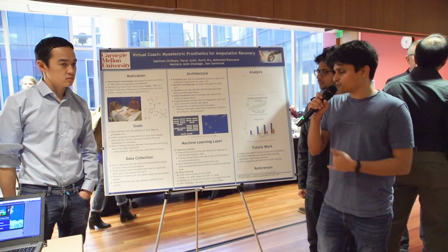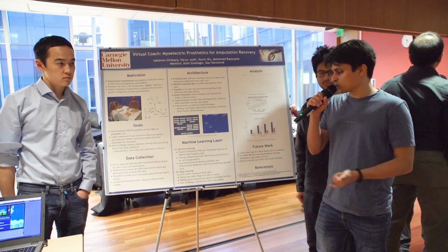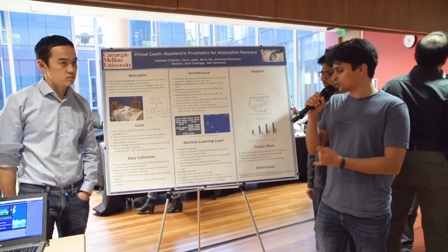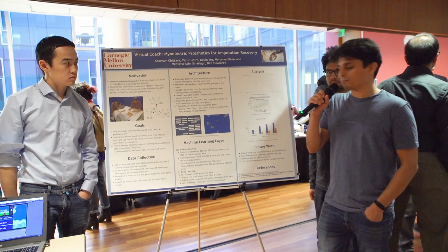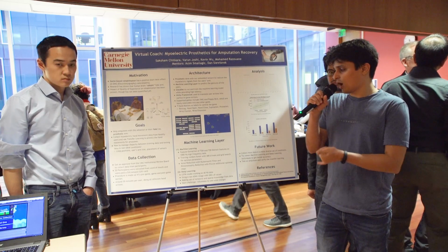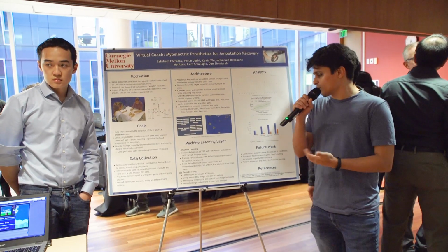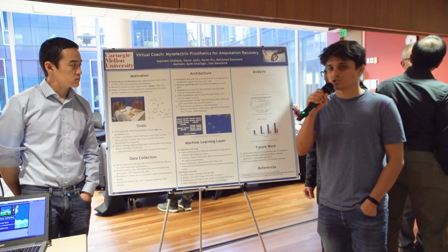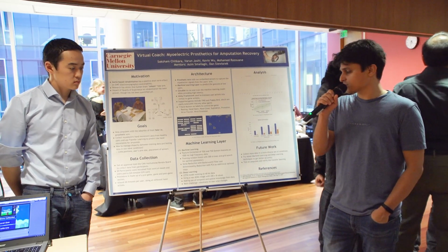We tried two kinds of approaches. We tried the traditional machine learning approach, where we did some feature extraction using temporal domain decomposition and temporal and spatial domain features. We tried this on 1000 hertz data as well as a bit on 40 hertz data. In the end, what we ended up going with was a random forest model with 300 decision trees, which ended up working best for our use case.